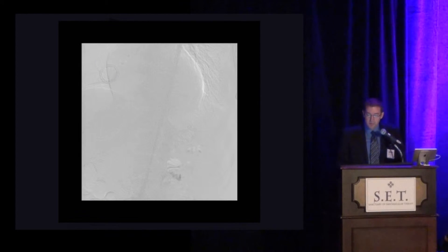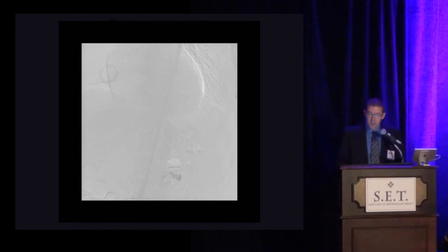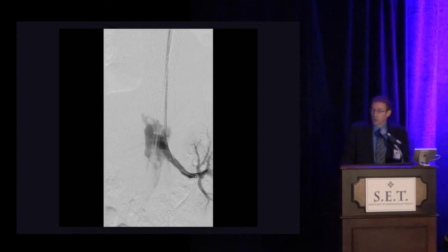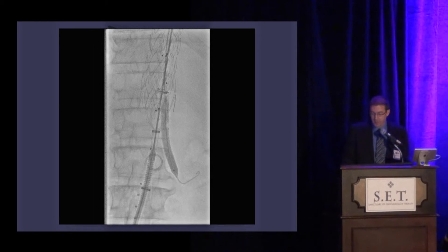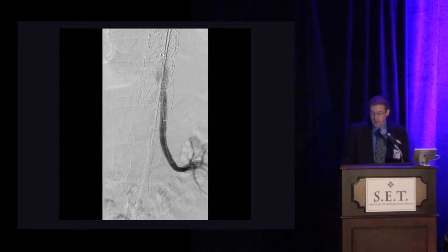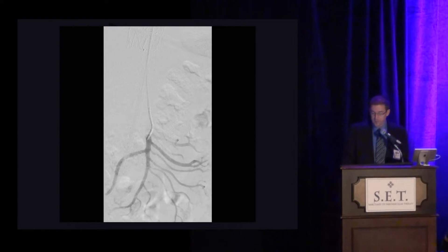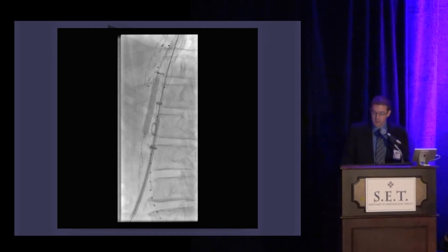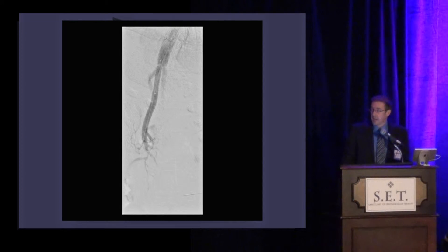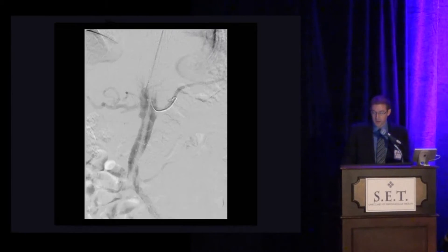Once we obtained access, this is the first aortogram. This shows the Valiant device, which I planned to put in first so the Endurant branch graft would land inside it for extra support. Here you can see our graft is deployed, and we're coming from the arm through the long Viabahn branch going to the left renal, connecting with an Atrium ICAST stent. Then we selected the SMA with another Atrium ICAST, and then the celiac with its Atrium ICAST and final run.